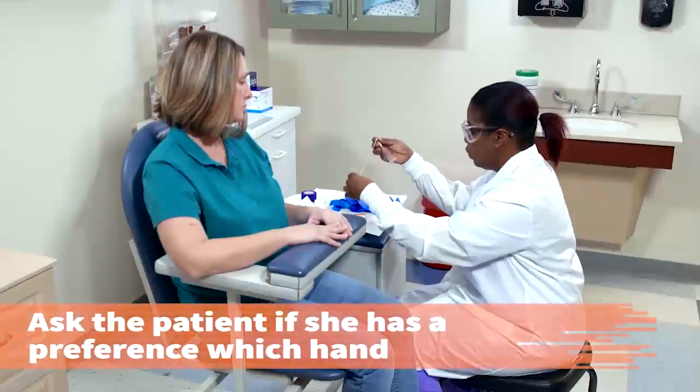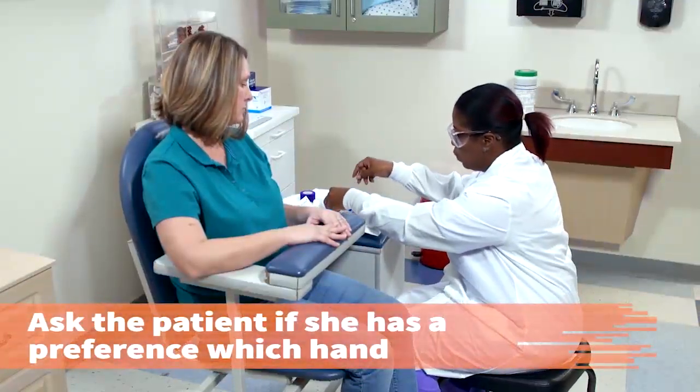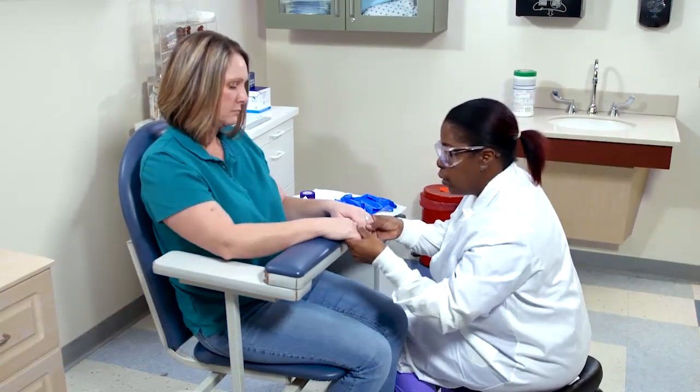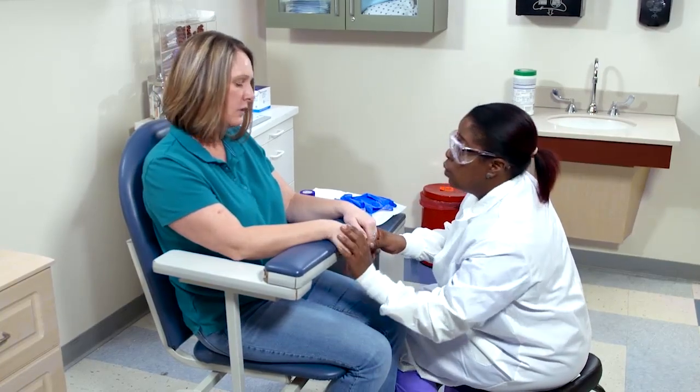Ask the patient if she has a preference which hand is used for the venipuncture. Let's put your hands out. Does it matter which one? No, not really.